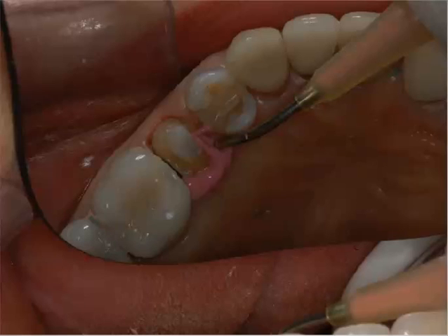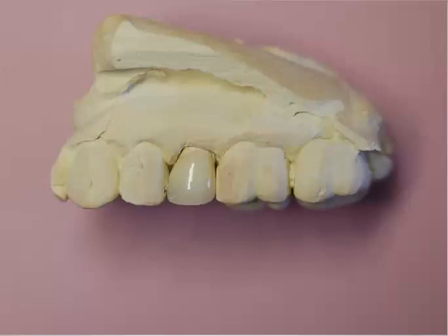So that's important, and we want to allow at least 0.3 of a millimeter extension beyond our margin, at least 0.3 of a millimeter width to that sulcus being open, to get the proper amount and strength of material into that area.